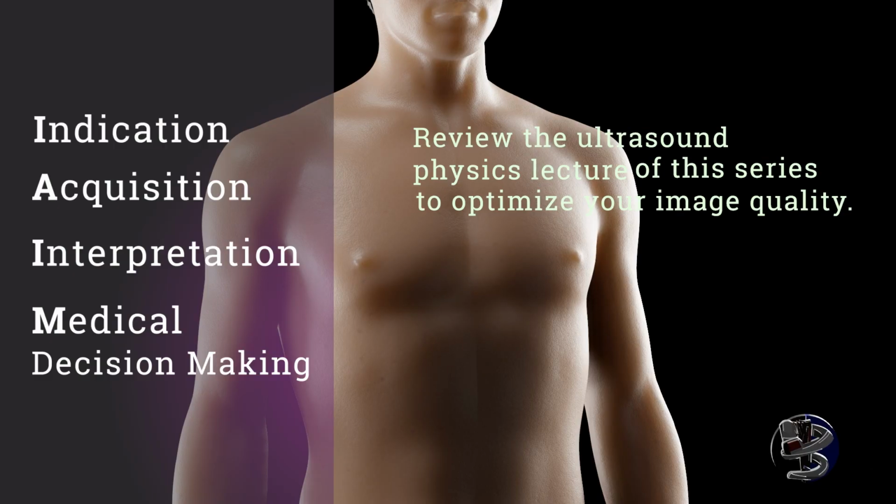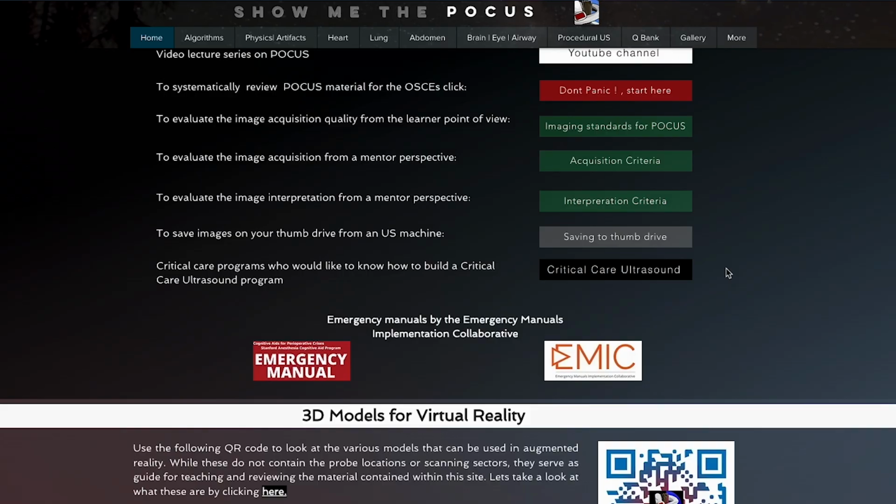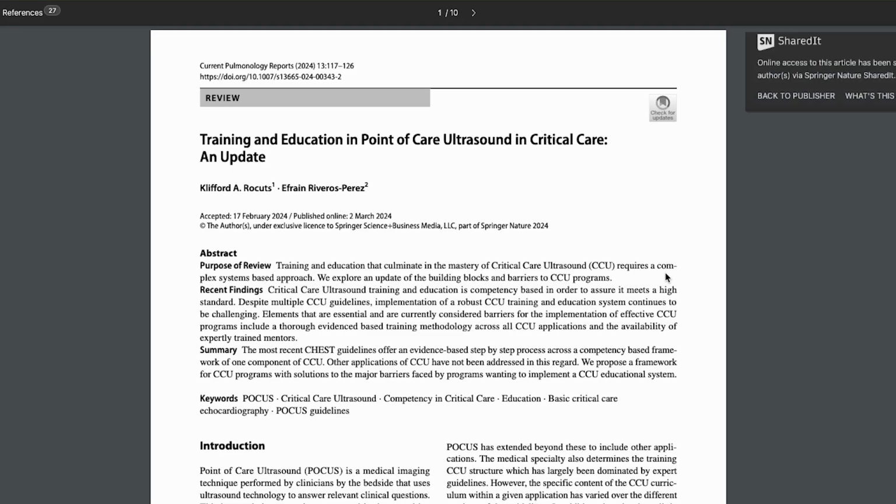It is important to note that competency in POCUS is through a practice experience pathway. Every patient encounter where POCUS is used needs to be supervised until competency is achieved. More information on the different pathways and methods of assessment can be found here on this link.